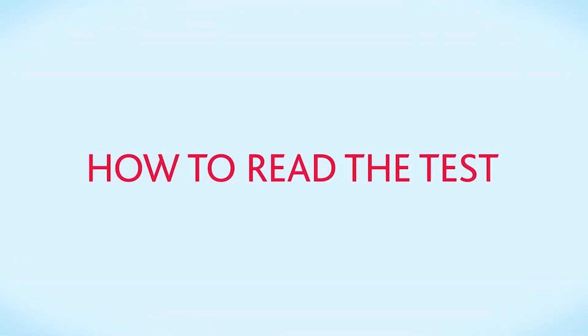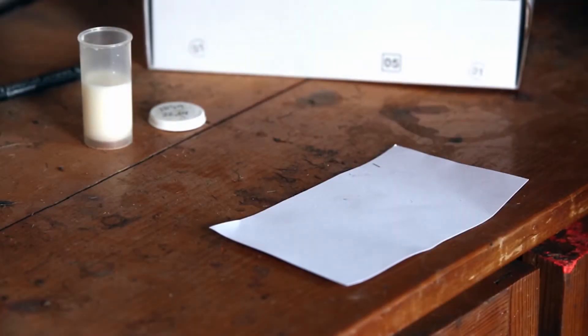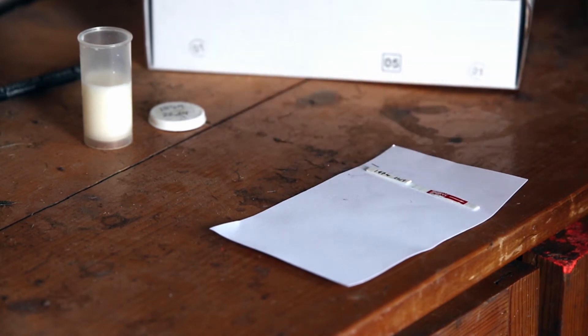You'll get the result in 5 minutes. To read the test, take the stick out of the milk and leave it to dry on a piece of white paper. Make sure there is plenty of light.